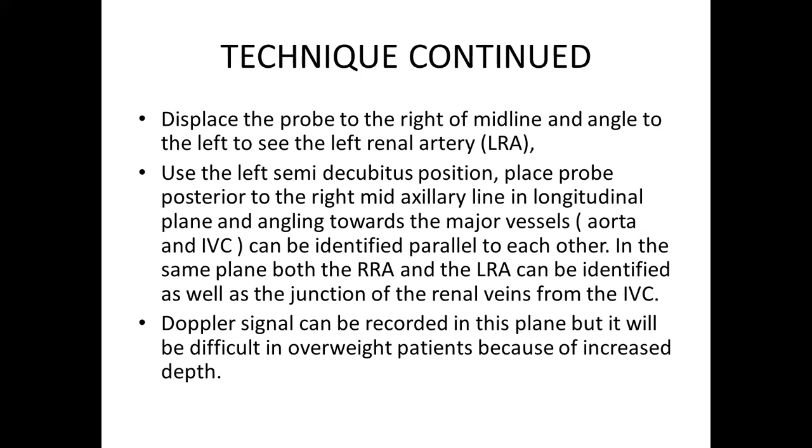I will show you the picture of this orientation. And in this view, you can also use the liver. The liver will be your acoustic window to see these vessels. We can also obtain Doppler signals and Doppler waveforms in this view, but it will be a bit difficult in overweight patients because of the increased depth.